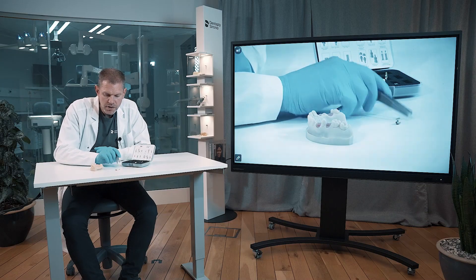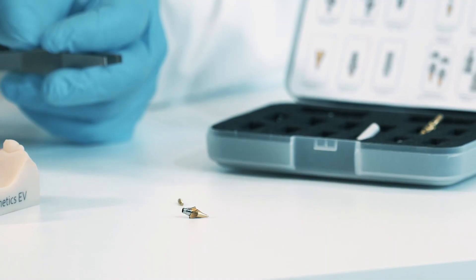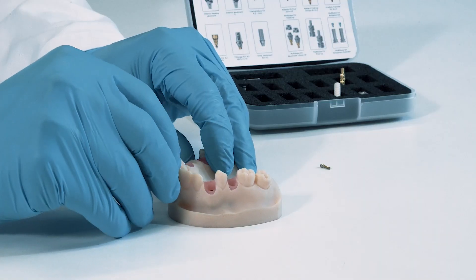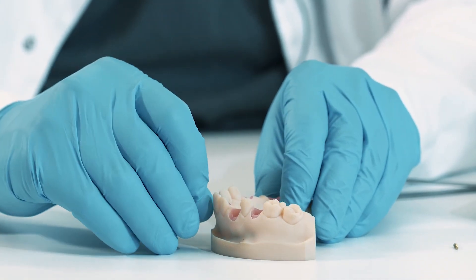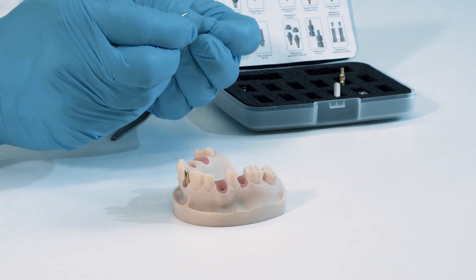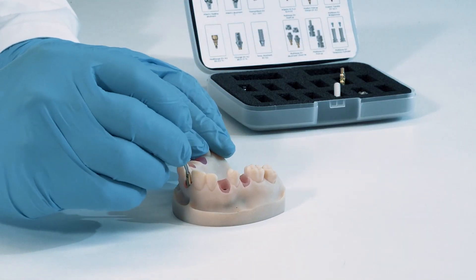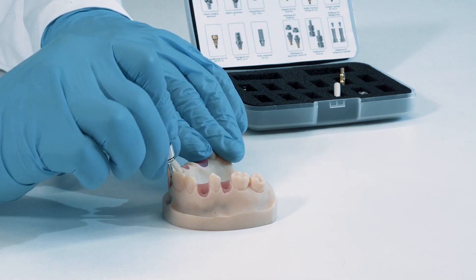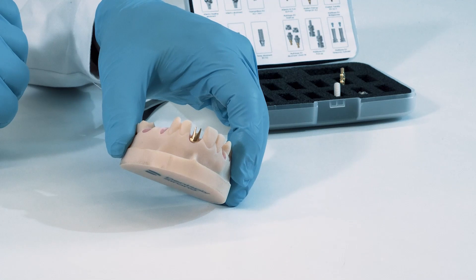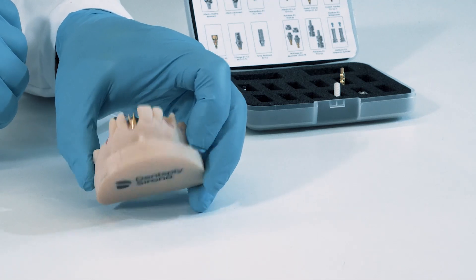You see here it has a separate screw that you must first place inside the abutment. To be totally sure that you fit this into the correct position, use your fingers to feel that you're all the way down. Then you can fit the screw together with the screwdriver — it makes it very convenient to just go in and tighten everything in one sequence. You have a perfect match between the soft tissue and this abutment margin.